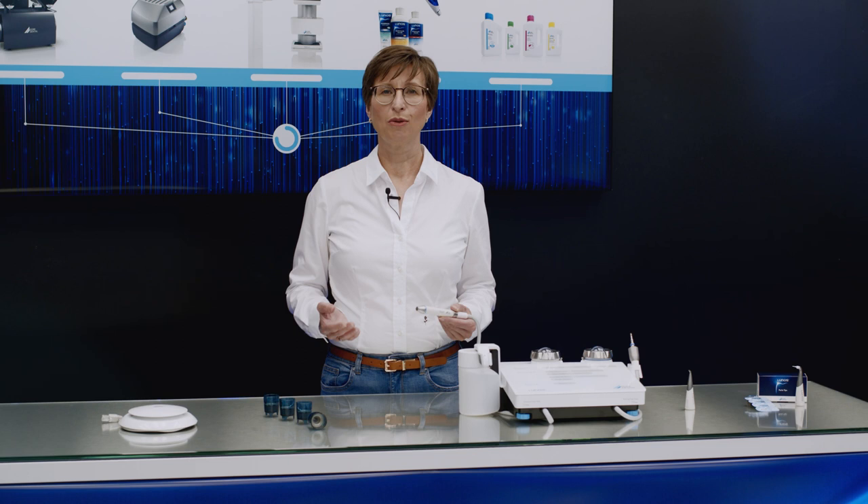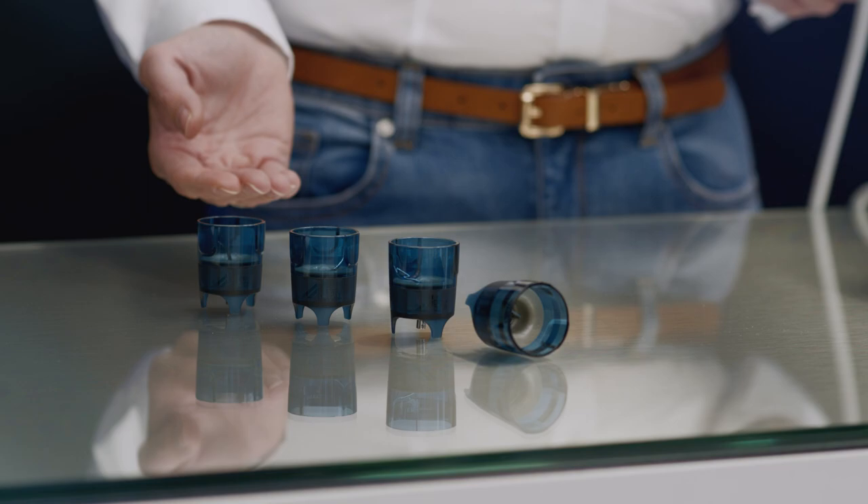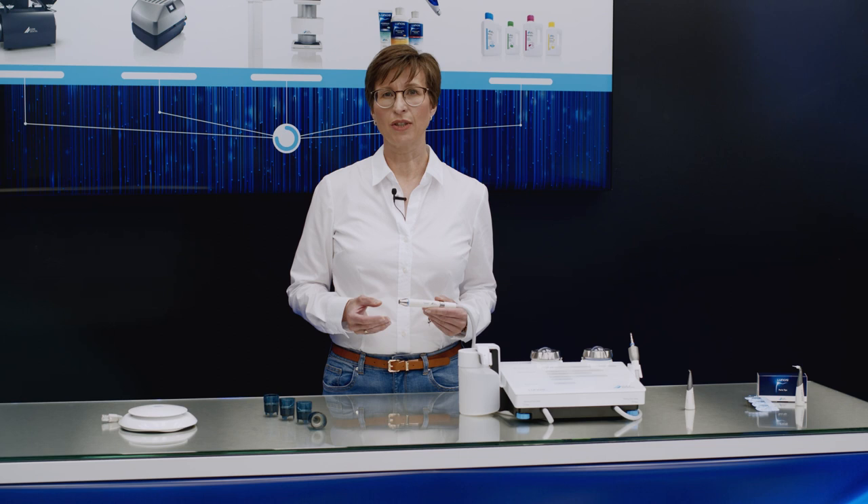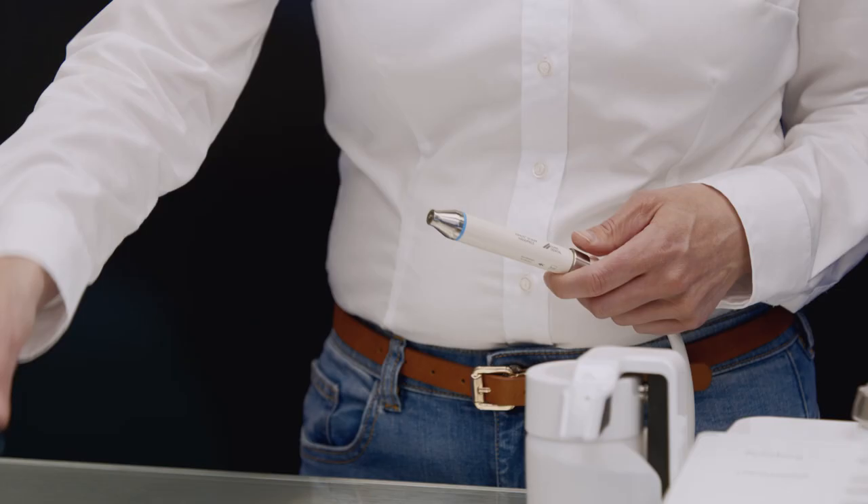MyLUNOS DUO offers a great choice of different scalar instruments to enable needs-appropriate use of the system in a wide range of treatment scenarios. The instruments are made of surgical stainless steel, and the IC1 attachment for implant cleaning is made of a high-tech plastic. All instruments and attachments are suitable for full cleaning and disinfection. Each instrument is supplied in its own torque wrench to enable it to be screwed directly and reliably onto the handpiece.